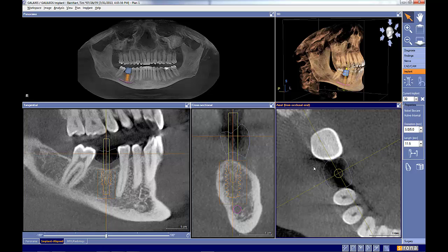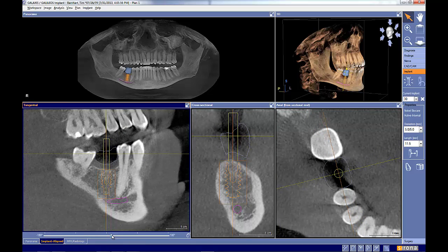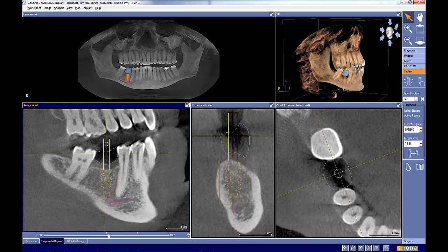Next, let's look at our occlusal table. We can see that this implant right here is coming out of the center of the tooth, pretty much dead center. The mesiodistal direction looks pretty darn good. And then let's look at the occlusal plane, which is right here. This is the area where I would say maybe, just maybe, we can be a hair better, in the sense that, looking at this, the occlusal plane is a bit this way. To help people understand what I'm referring to, if we draw a straight line across here, we would see that the occlusal plane looks like that.